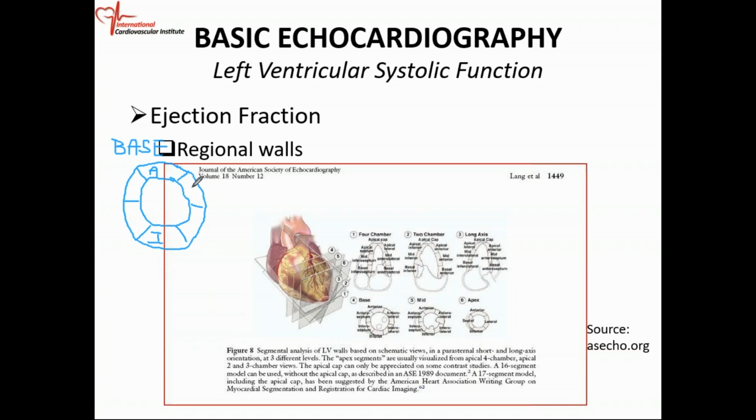And over here, I've been telling you, it's the lateral wall. This is the anterior lateral wall. So we can use AL to designate this. And then this is again a lateral wall, so this would be the inferior lateral wall down here. Let's designate it IL.